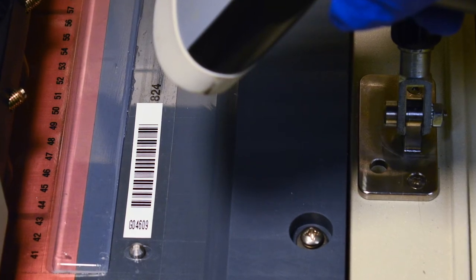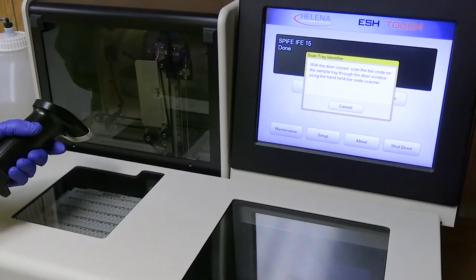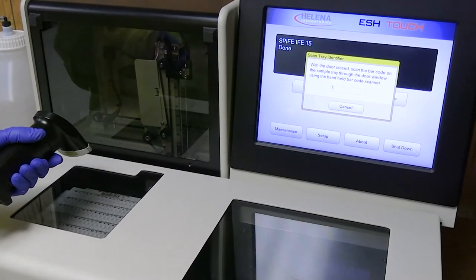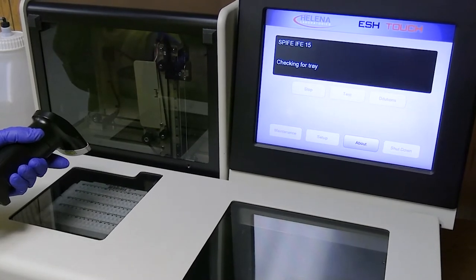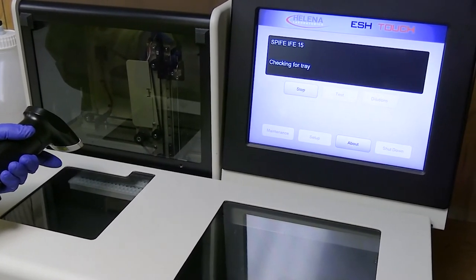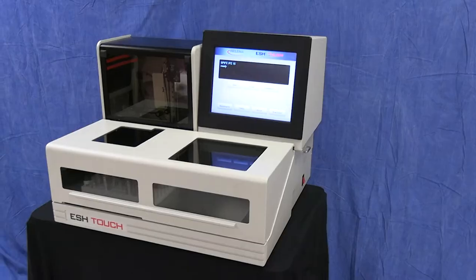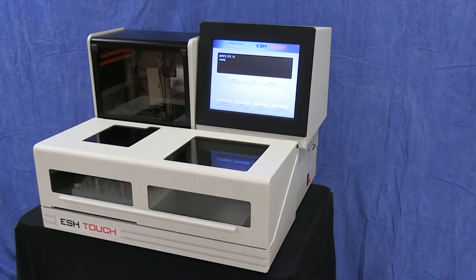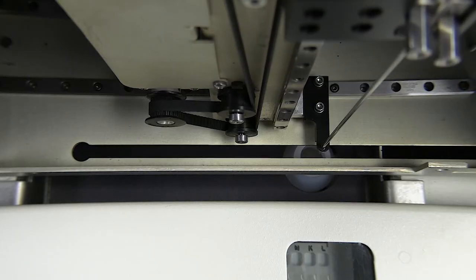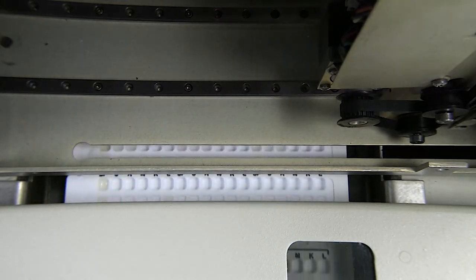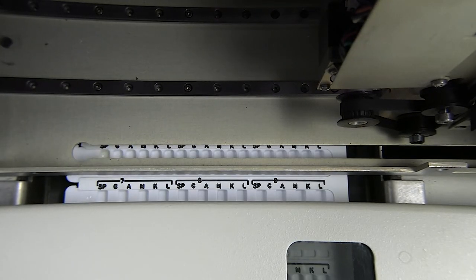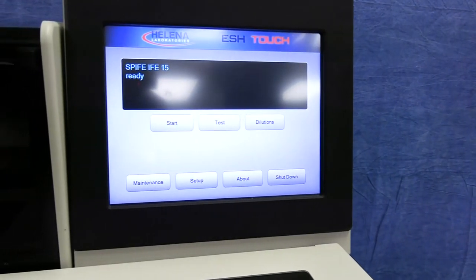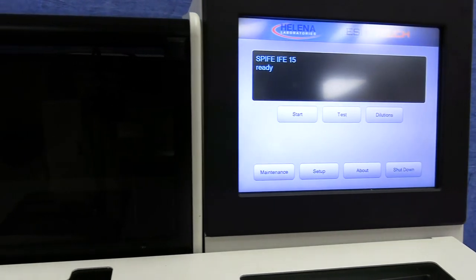From the sample tray to the finished gel, matching patient demographics are downloaded from the LIS system by the QuickScan Touch Plus densitometer. The ESH Touch is an integral part of the Touch series of instruments that includes the SPIFE Touch electrophoresis analyzer and the QuickScan Touch Plus densitometer.